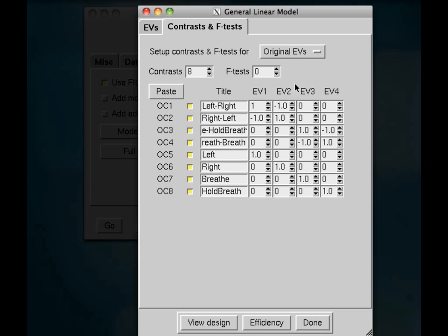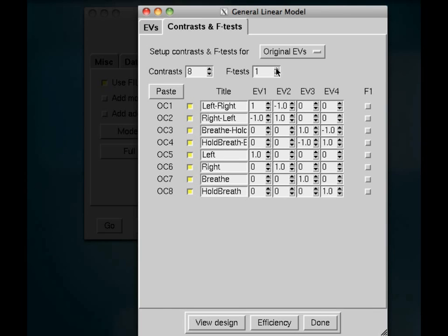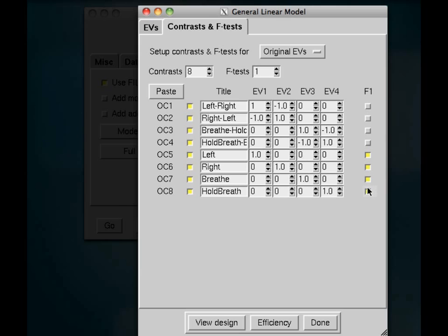And I'm not going to be calculating them now, but say if you want to calculate some sort of F-test, which can calculate whether there's an effect of multiple contrasts simultaneously, you can go ahead and do that. So if, for example, I wanted to see whether there was an effect of any one of my regressors, I could select an F value for, or just select this F1 box for each of my regressors. I'm not going to do that right now, but you can.